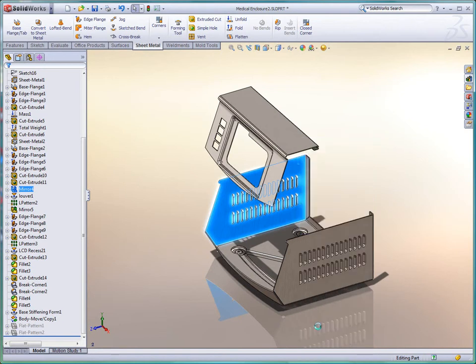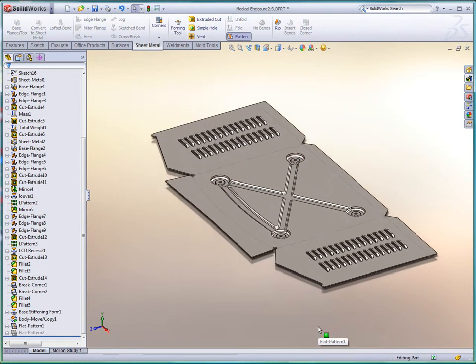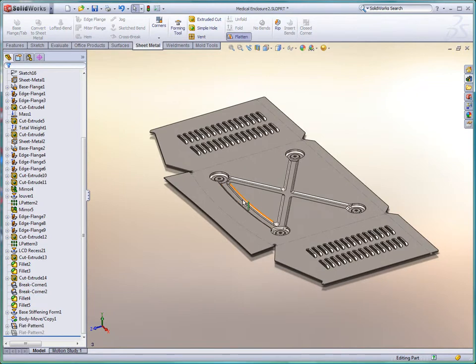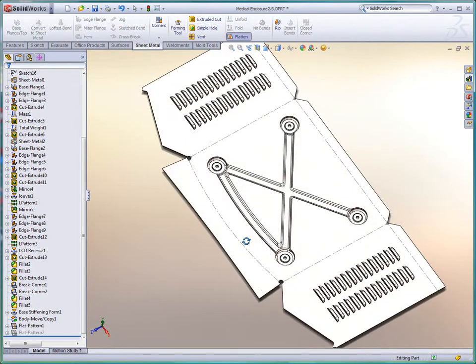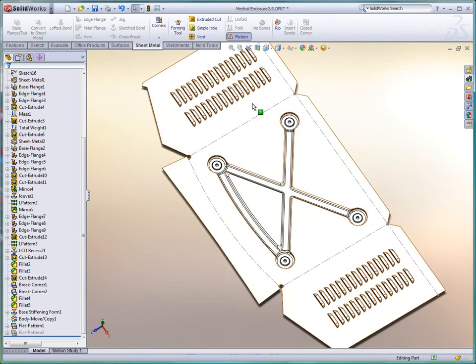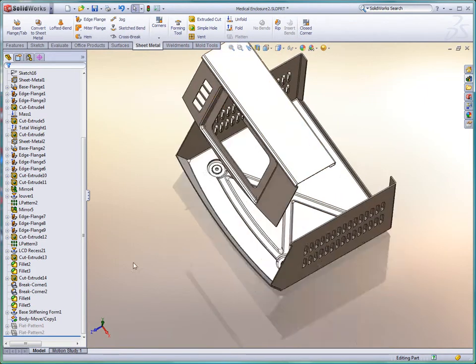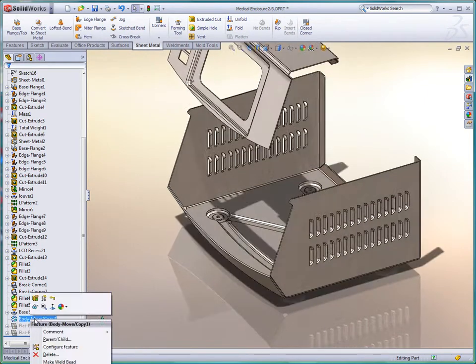Complex fabricated parts are easily visualized, including form features such as stiffening beads and vents. Curved flanges add a fresh and modern appearance. And for manufacturing, the exact flattened shape is just a button push away.